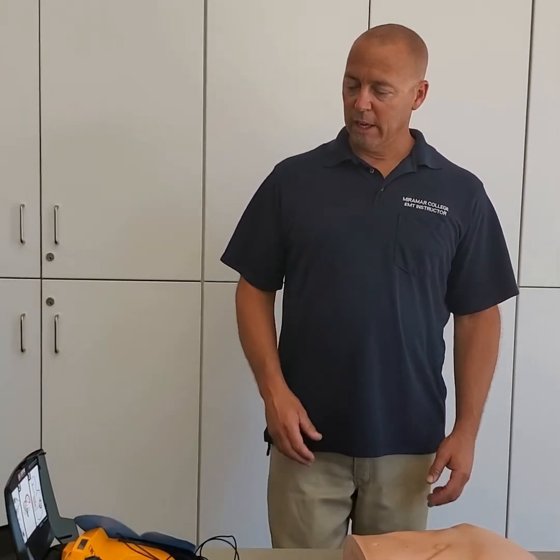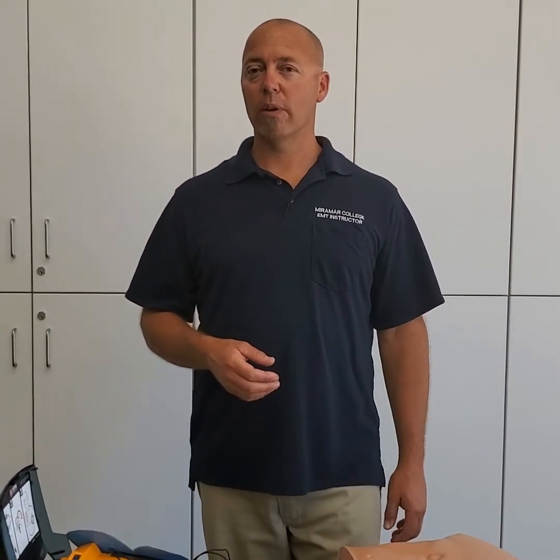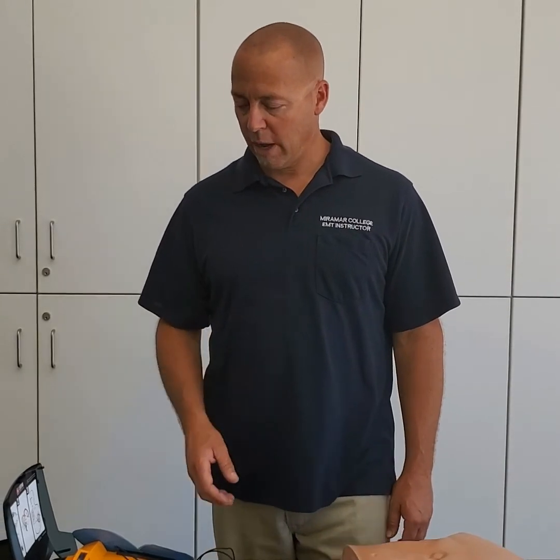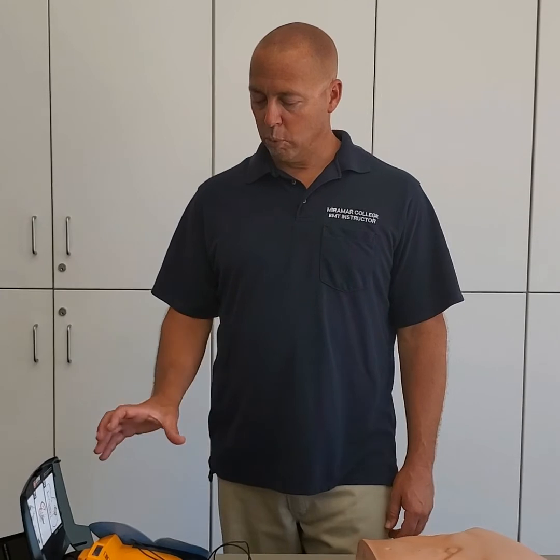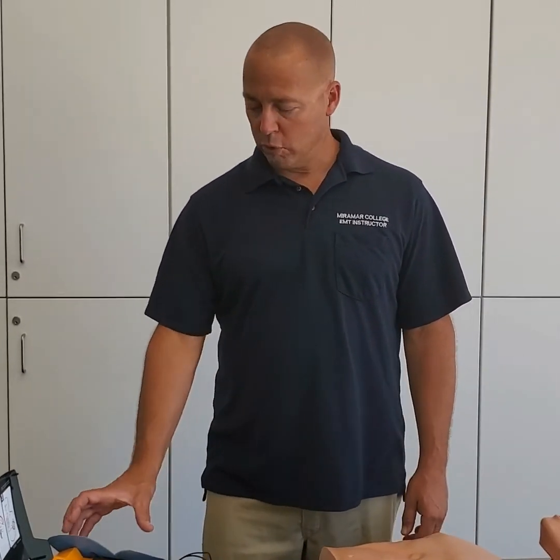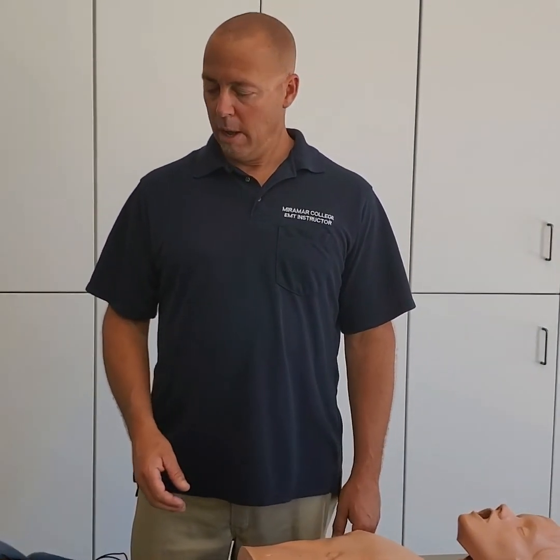And again, just to make a point, the AED is designed to shock two different rhythms: ventricular tachycardia and ventricular fibrillation. Once we turn this machine on, we leave it on, we don't turn it off. Once we put the pads on our patient, we don't take the pads off, we leave them on. All right, that's pretty much it.